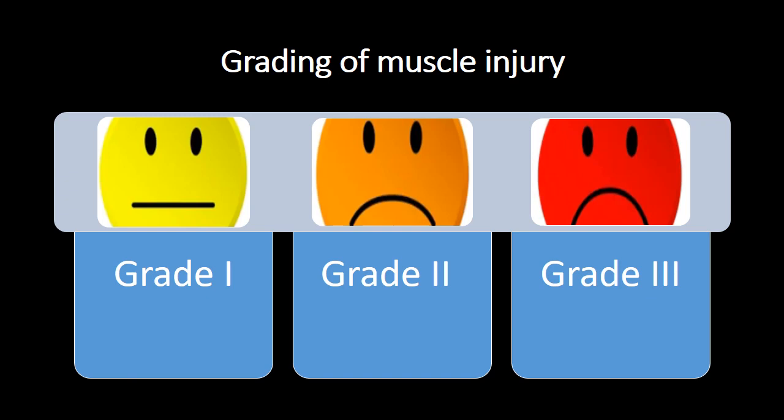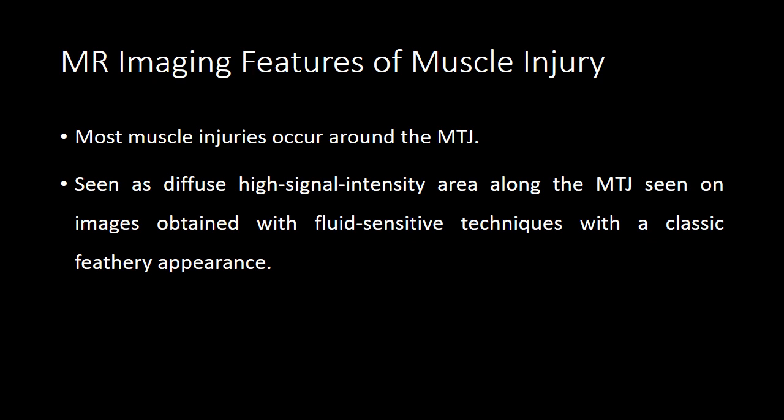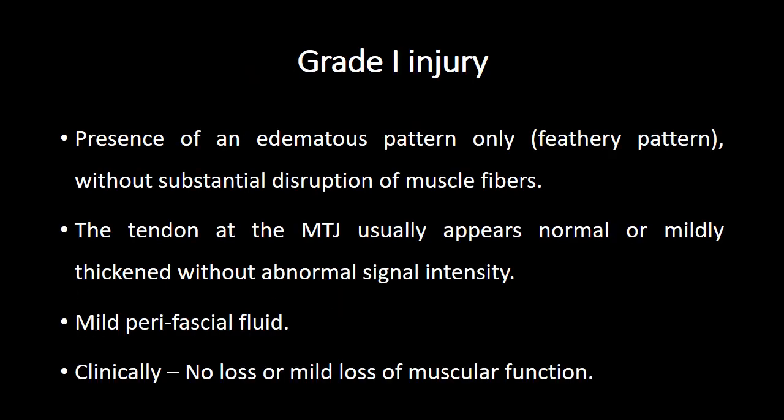Muscle injuries are graded into grade 1, grade 2, and grade 3 depending on the severity. Most muscle injuries occur around the myotendinous junction and this is seen as a diffuse abnormal area of high signal intensity around the myotendinous junction, giving a classical feathery appearance. Grade 1 injury is presence of diffuse muscle edema without obvious disruption of the muscle fibers. The tendon at the myotendinous junction appears normal or mildly thickened. There can be a mild degree of perifascial fluid, and clinically there is no loss or just mild loss of muscular function.